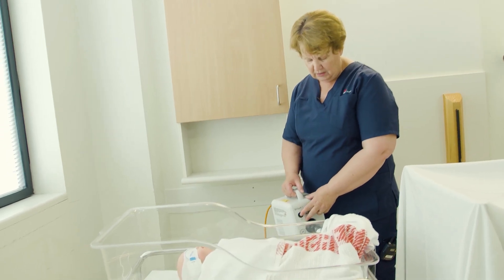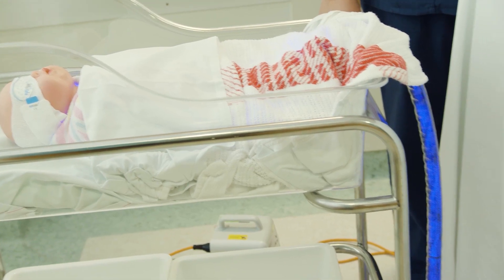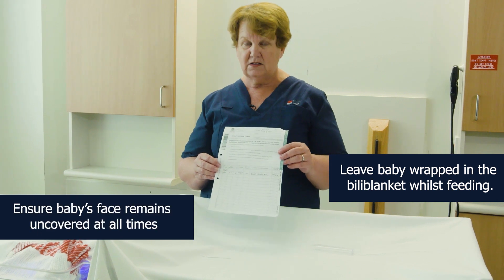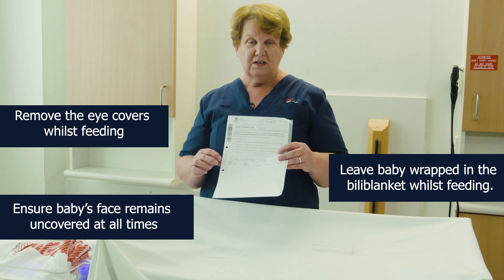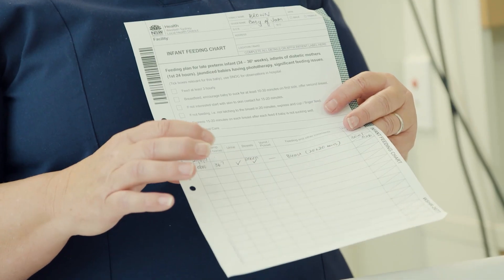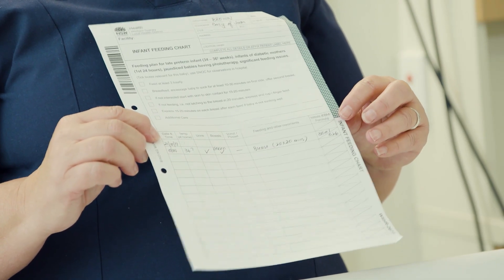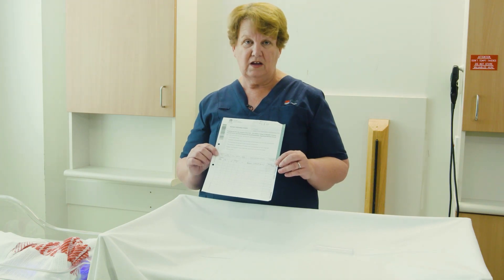With the simple switch at the front, press on — your baby is now under light therapy. During treatment we like to keep a record of feeding, so we supply you with a feed chart. Simply keep an idea of timing; we like the baby fed every three hours. Mark wet and dirty nappies, how the baby breastfed, and if taking extra formula, how many mls the baby took.